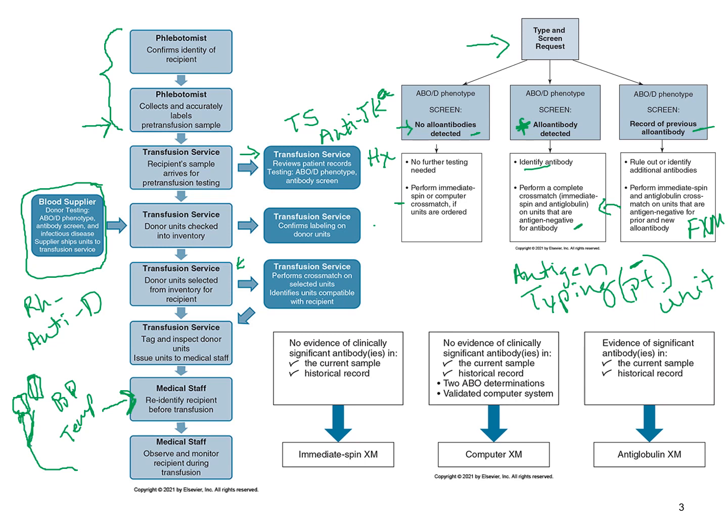But when you start that timing to watch that transfusion, it takes a little bit of time for that blood to actually travel through that tube and then actually go to the patient. So one of the things that you have to do is just make sure you're observing that line, that you're not starting that time interval until it actually starts to enter the patient, because this could be 5 or 10 minutes, and that you're watching this go through this line. It probably really doesn't take that long, just a few minutes, but it takes a little bit of time for it to travel through that line. So once it gets to the patient, that's when your timing actually starts, and then you observe.